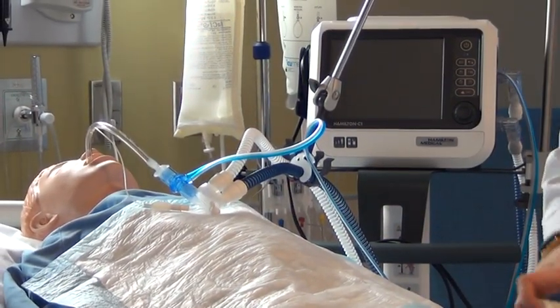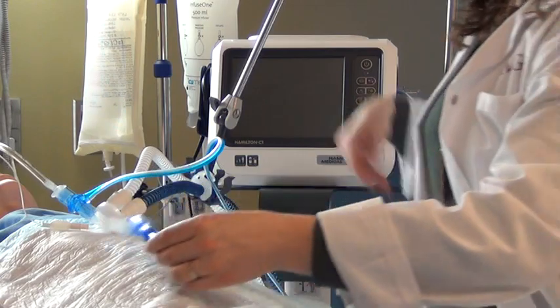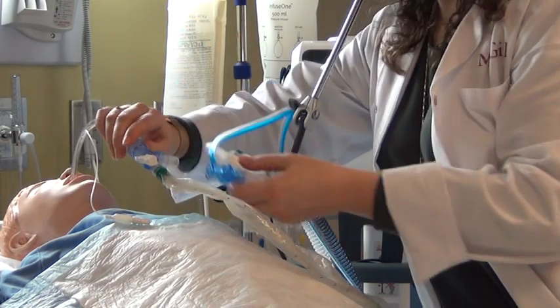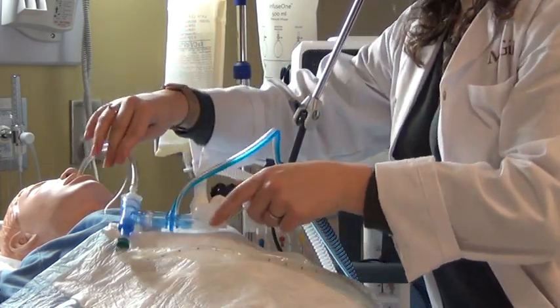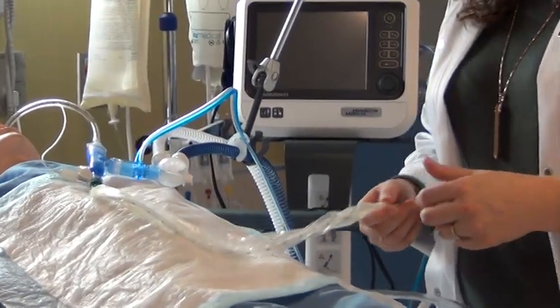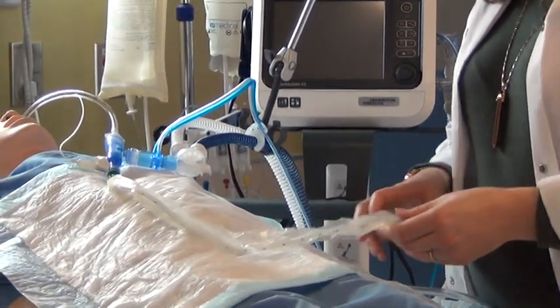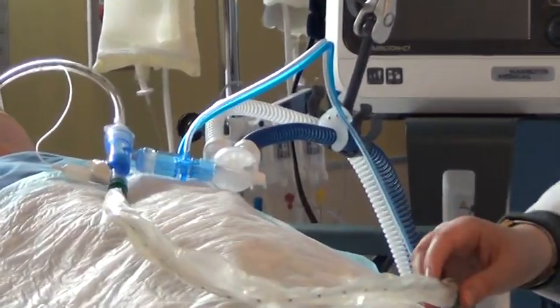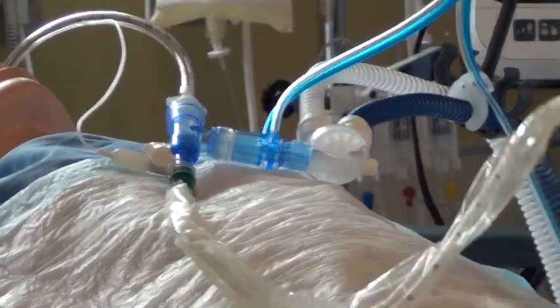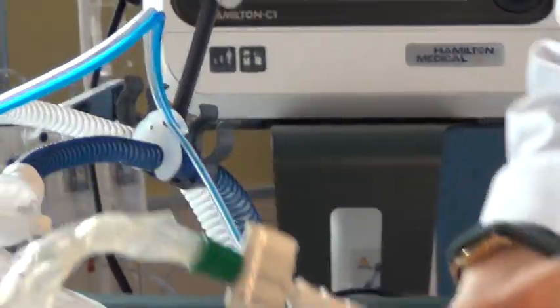One of the devices that we often use in critical care settings, however, is an inline suction. So this device here would actually connect a little bit differently, like this, to our patients. And what this will do is, if our patients require a lot of suctioning, if they had a pneumonia and had thick secretions that we often needed to remove, we can remove them using this device instead of continuously inserting a new suction catheter every time. So this here would be connected to our wall suction and would remain like such on our patients.